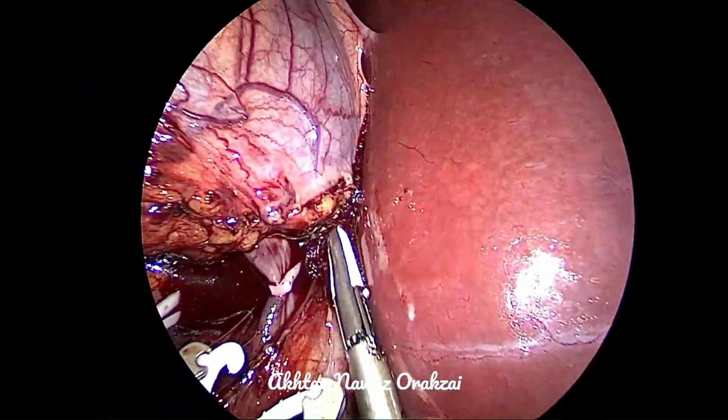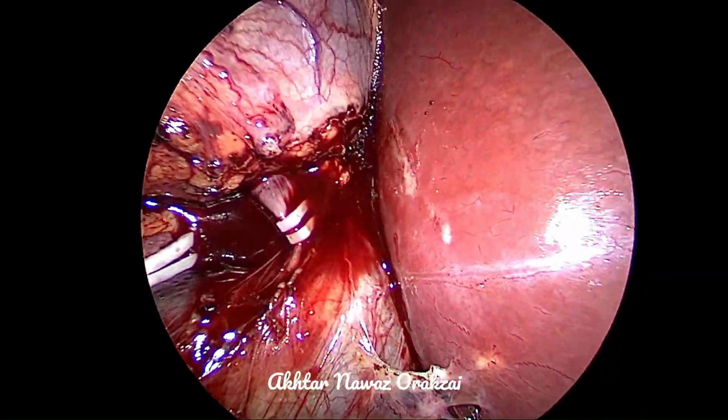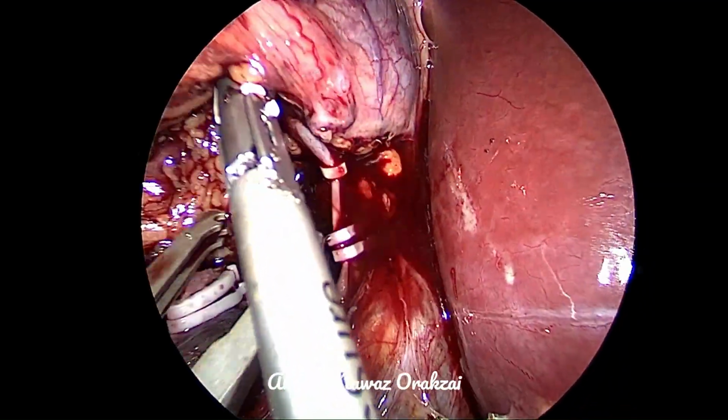If it was in my right hand, I would have been right over the vein, so it would have been difficult to apply the Hem-o-lok clips as well as do other dissection with the right angle.